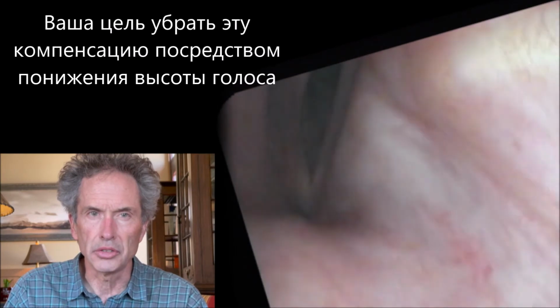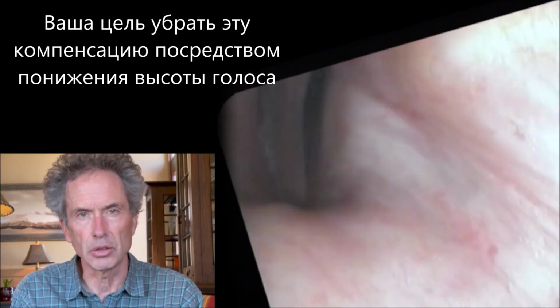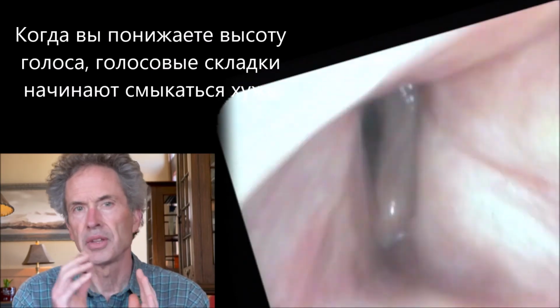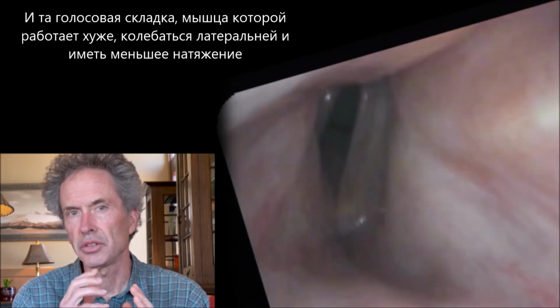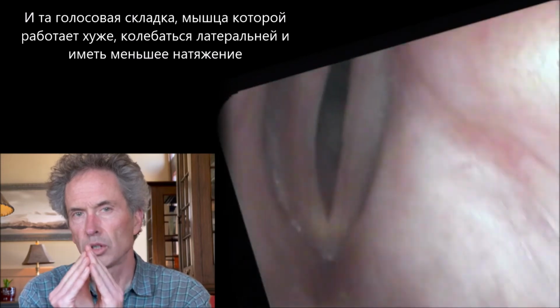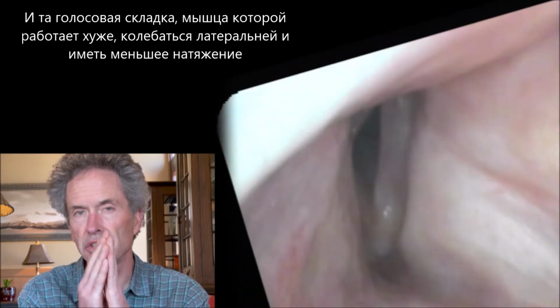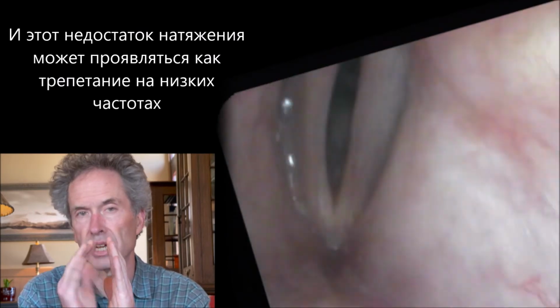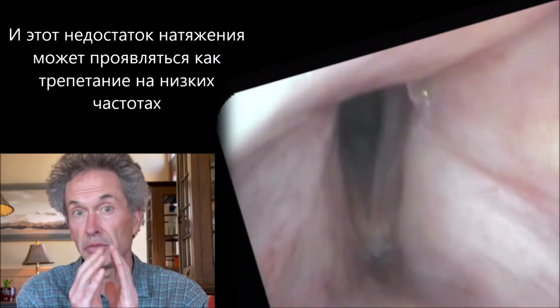Your goal is to remove that compensation, and you do that by lowering the pitch. When you lower the pitch, the vocal cords come further apart, and the one that has a thyroarytenoid muscle weakness will go further laterally, have less tension, and the lack of tension can be very apparent as flutter at a very low pitch.